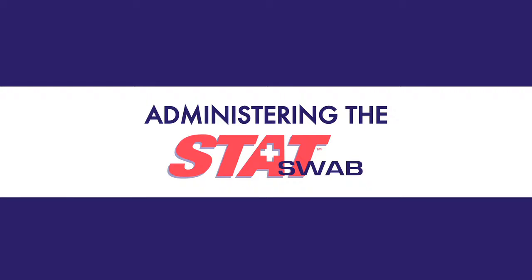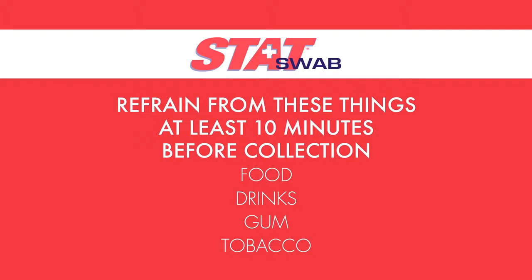Administering the StatSwab. When you're ready to administer the StatSwab test, instruct the donor to refrain from placing anything in his or her mouth for at least 10 minutes before collection. This includes food, drinks, gum, and tobacco products. Use this period to go over paperwork and instructions with the donor.